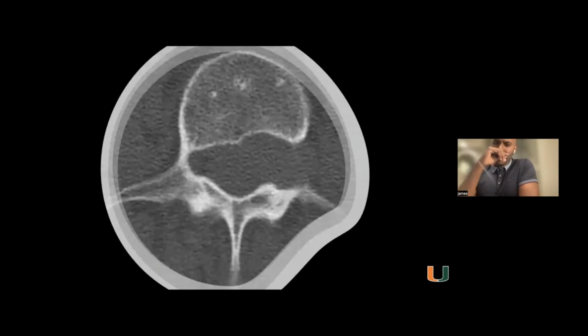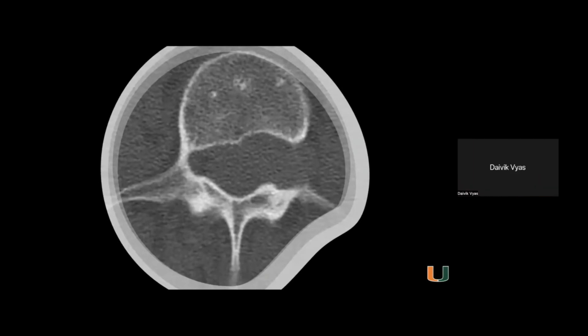So what additional workup, and when I say workup, I mean imaging studies. The plan here is going to be to go for surgery at some point, but you've got to think about what other information you want that's going to help with characteristics of the tumor and with operative planning. Maybe a CT of the spine as well. Maybe a CT scan, yeah, to look at the bone quality. CT scan was what we were getting at. And what are you seeing here in the CT scan?